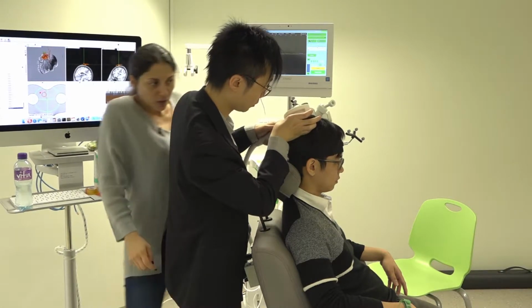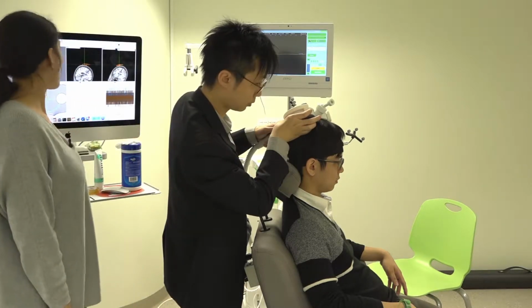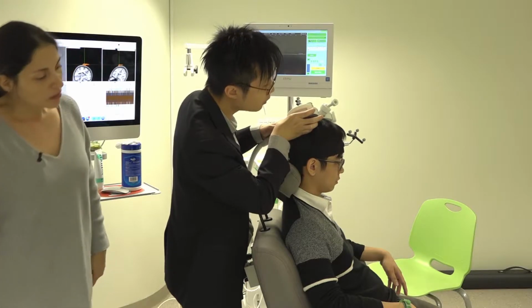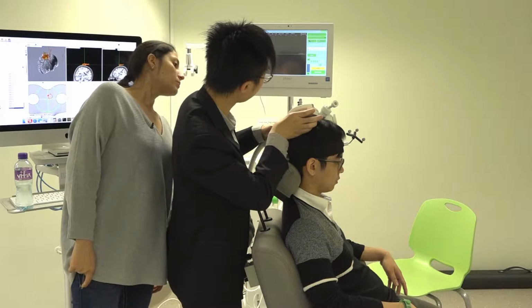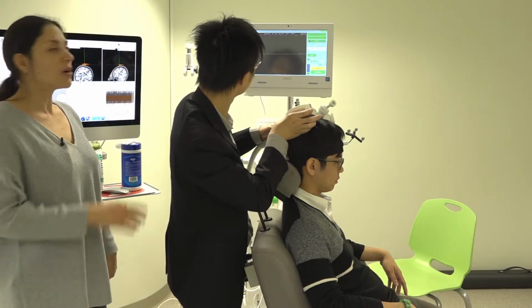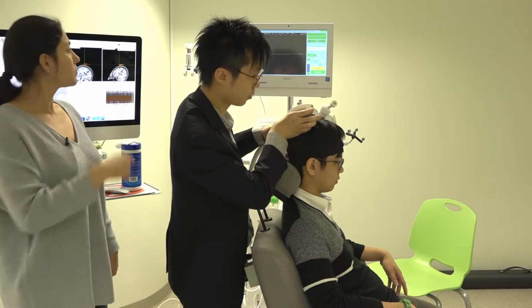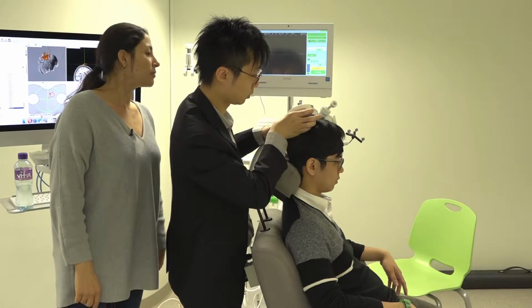Let me see the position of the coil. No. Almost, you are somewhere. So you start to see some responses. Yeah, good. Stay there.